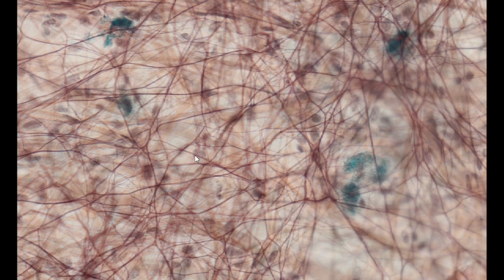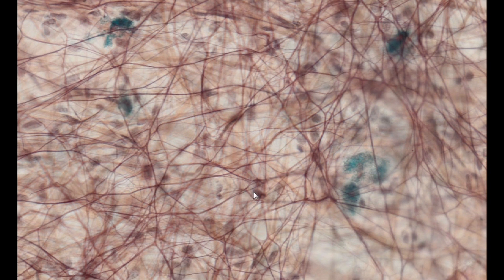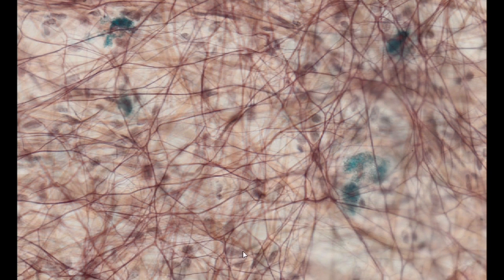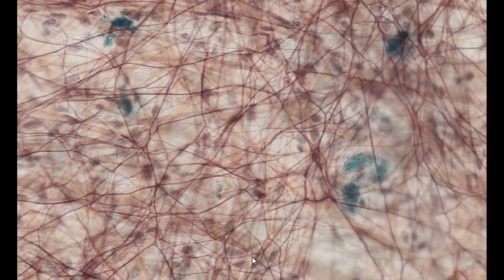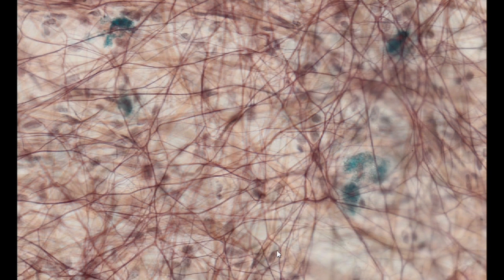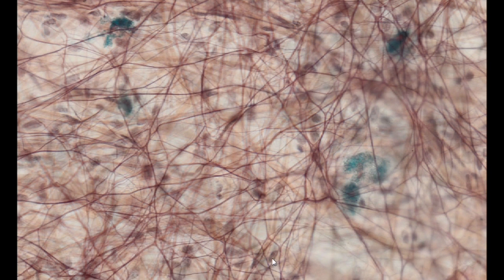Let's take a closer look at the nuclei of connective tissue cells visible in the specimen. Although staining with orcine does not allow to clearly distinguish the individual populations of connective tissue cells, it is very likely that the most elongated nuclei belong to the population of fibroblasts.